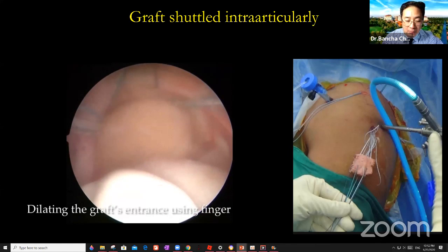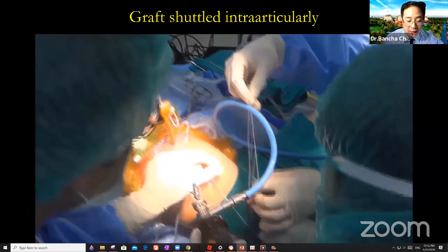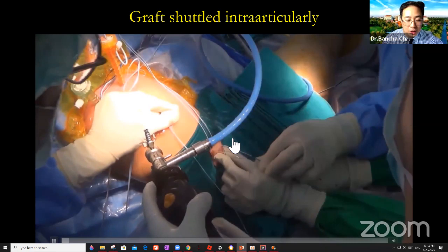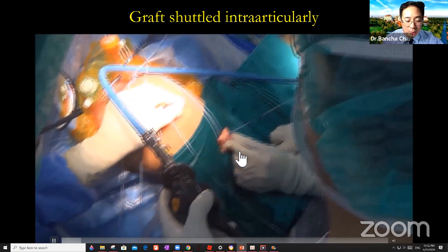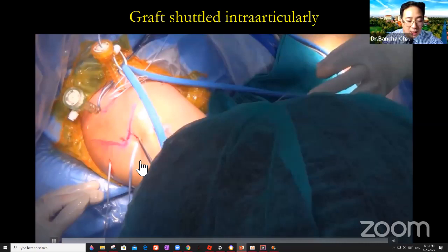And then next step, I use my finger to dilate, okay? That way, okay? So the size of your index is enough to put the graft in, okay? And then next step, okay, we put this suture. Okay, now we're ready. And this is our suture in the graft. We put the thicker part on the medial side. Okay. And the next step is I put the 10 cc syringe and retrieve the suture one by one and pass into the graft.